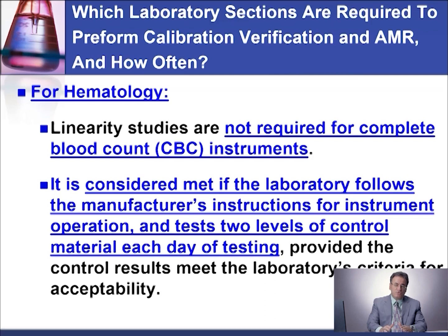That substitutes for the calibration verification and linearity. If you are not getting this kit from your vendor, ask for it, because it should be part of your contract, part of your instrument purchase.